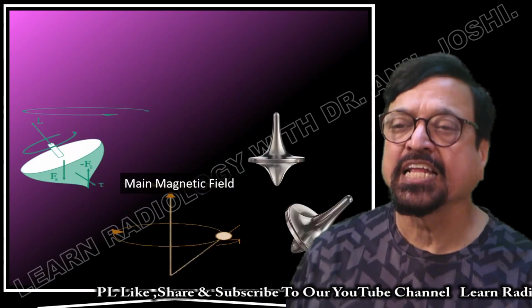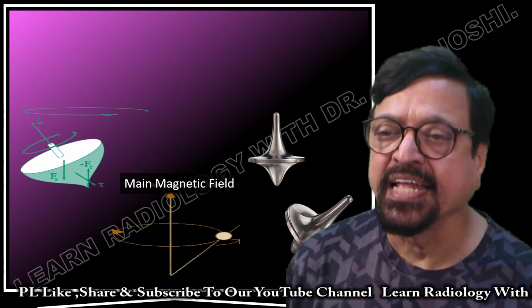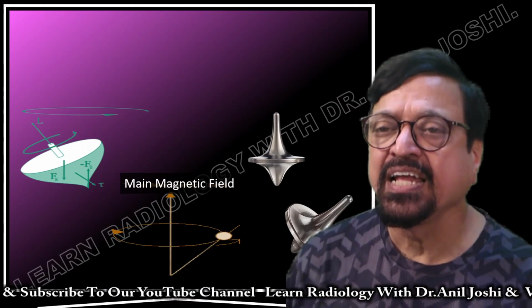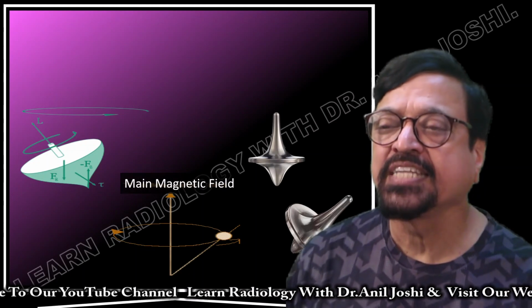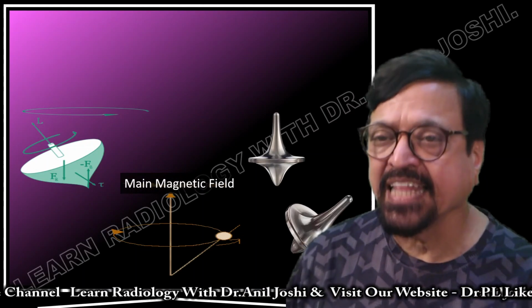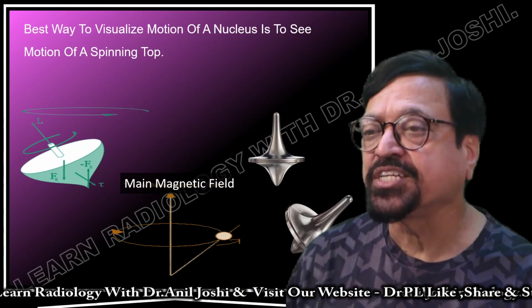Now here again we are explaining it in more detail. You can see the first spinning top is wobbling. Wobbling is precession. Now you are seeing three diagrams. In that, one is in rotation, that is in angular momentum. The second is in a steady rotation and the third is wobbling. These three things depend on the angular momentum and gravitational forces.